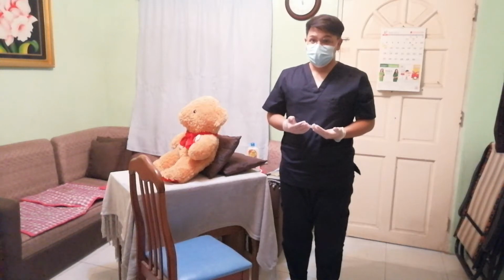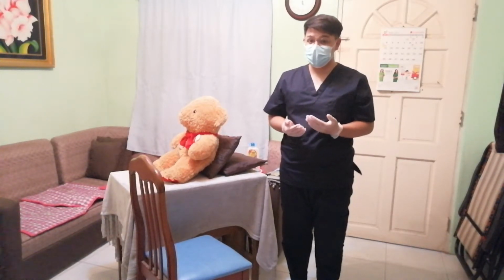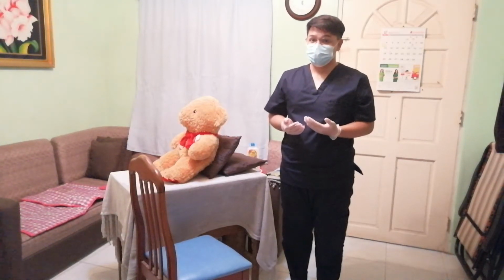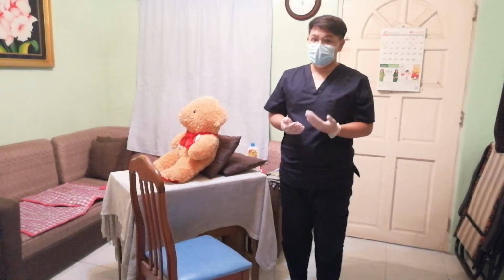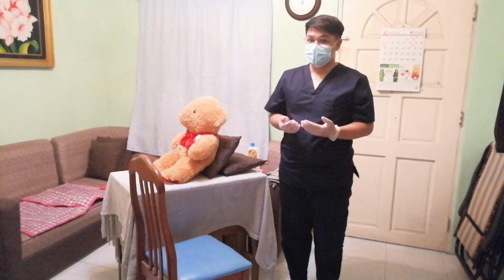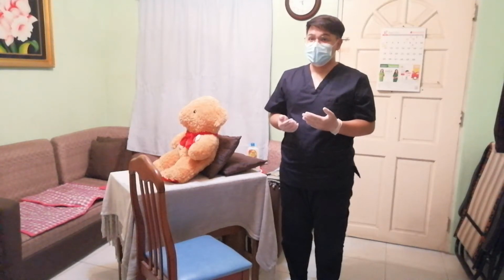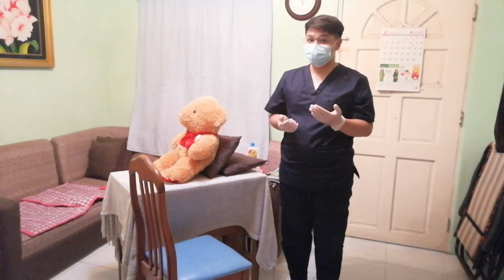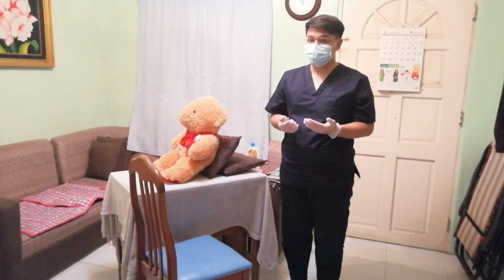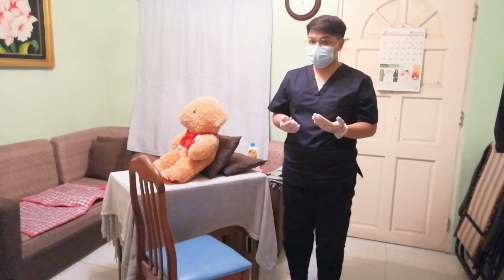We will now proceed to our next step, which is we need to encourage our patient to make use of the stand assist device, either freestanding or attached to the side of the bed. After that, we need to move the patient to a side-lying position, facing the side of the bed towards which he or she will be sitting.